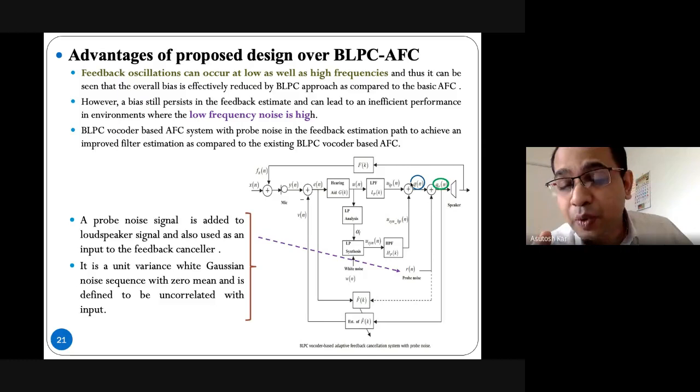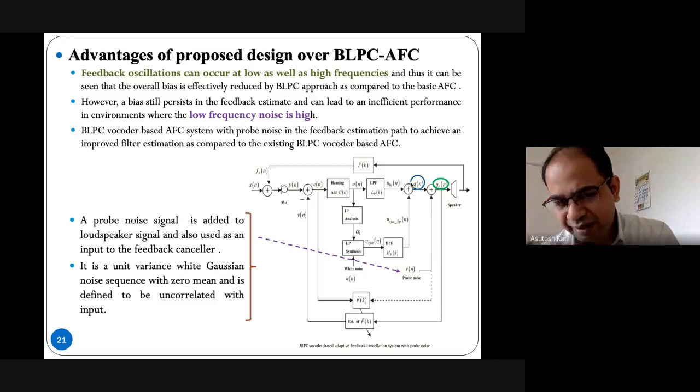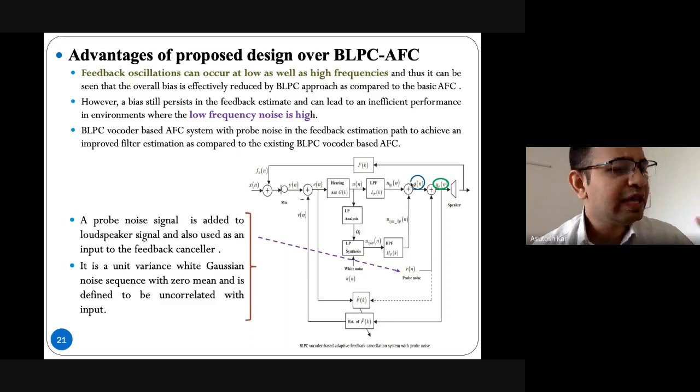At the same time, when we carefully selected it and did the experimentation in our lab, we found that addition of probe noise along with the high frequency bias also addresses the low frequency bias properly. So for the existing BLPC vocoder based feedback cancellation, we tried this probe based approach, and with simple modifications and adaptive filtering, we found the performance is good. Performance is good, that is a part of the result. Sometimes in simulation and results, we get really encouraging performance.